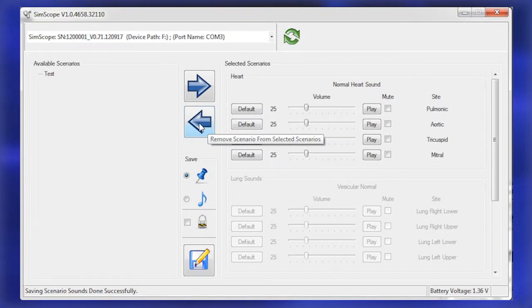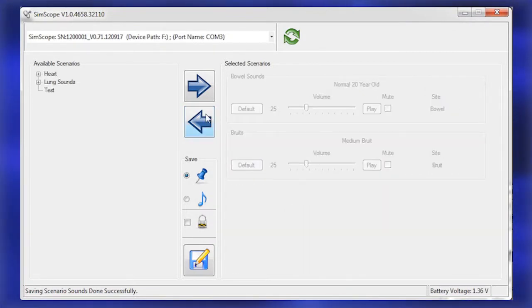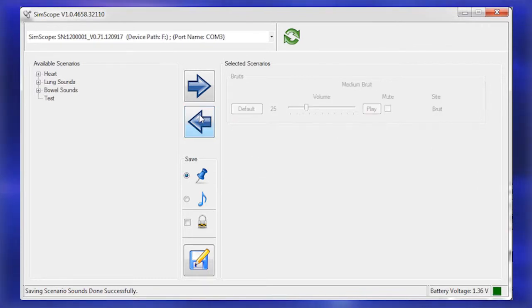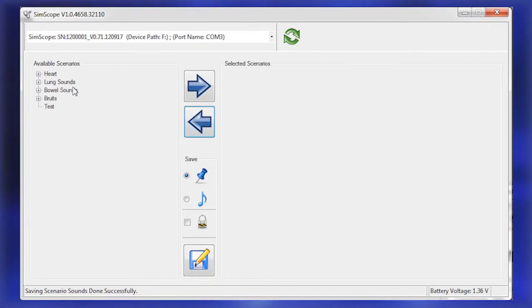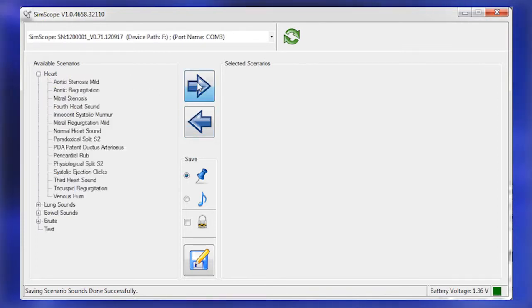Select a sound group under the Selected Scenarios by clicking a group. Move the sound group to the Available Scenarios box by clicking the left pointing arrow icon. Expand the newly populated sound group by clicking the plus icon.